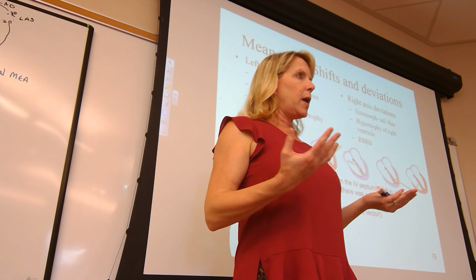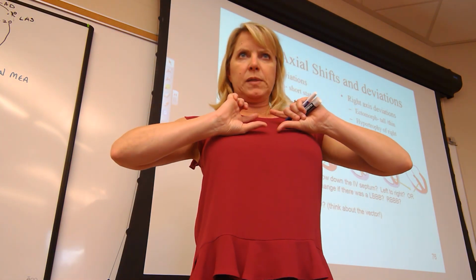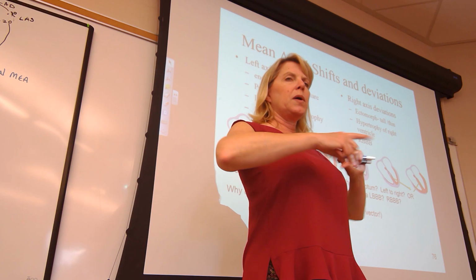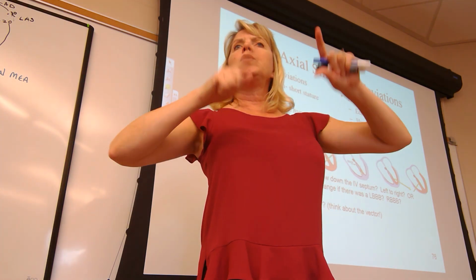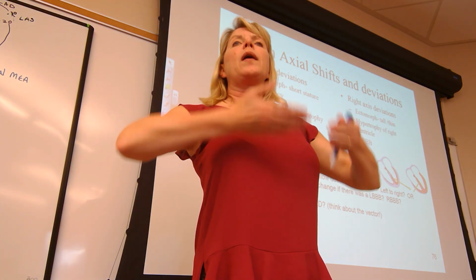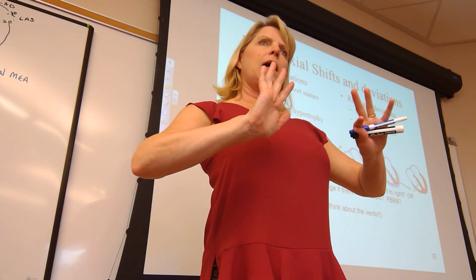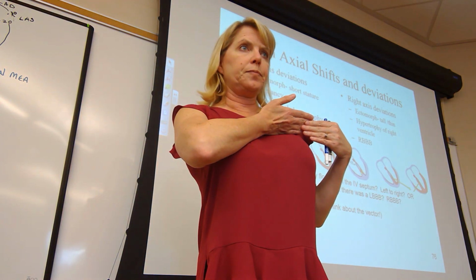So when we have a break, I encourage you to use more of those compass pictures to map out the person in your group, their normal MEA, and then use 2 more pictures to map their MEA when they held their breath in. The MEA should be more towards the right. And when they exhaled and held their breath, their MEA should be more towards the left.